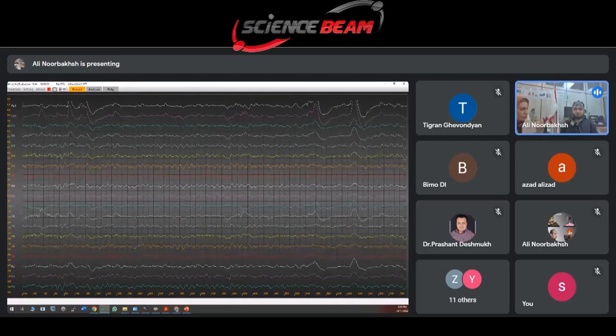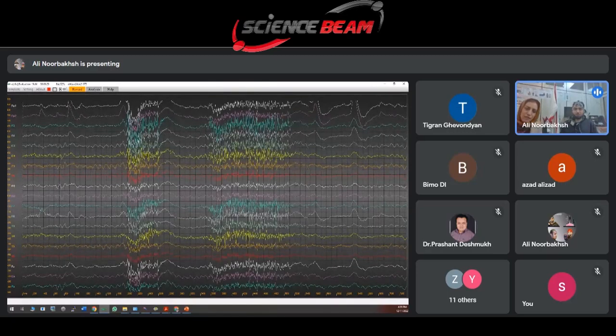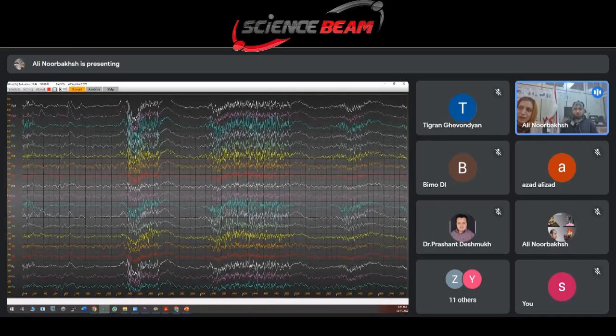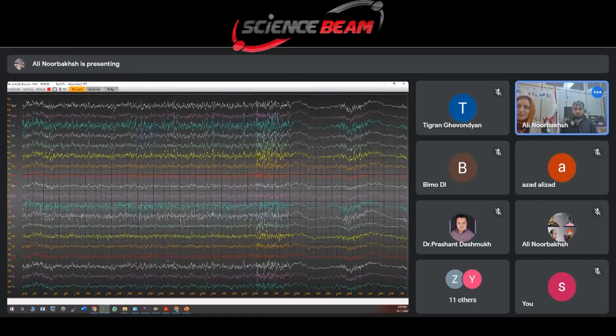Please press your teeth. Can you see the EMG artifact? This is an EMG artifact. Okay, stop.